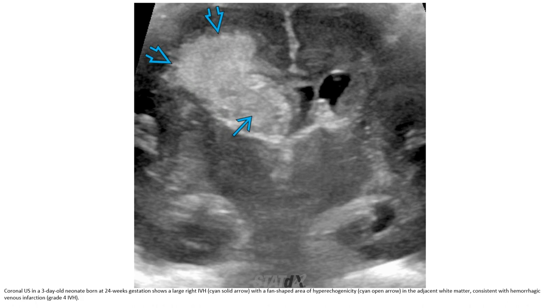This is the ultrasound in a three-day-old neonate born at 24-week gestation, showing a large right intraventricular hemorrhage with a fan-shaped area of hyperechogenicity in the adjacent white matter, consistent with hemorrhagic venous infarction.